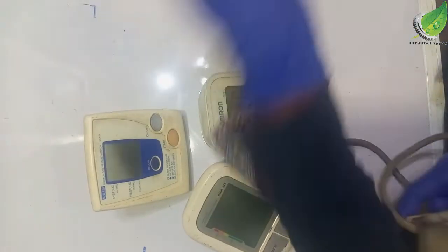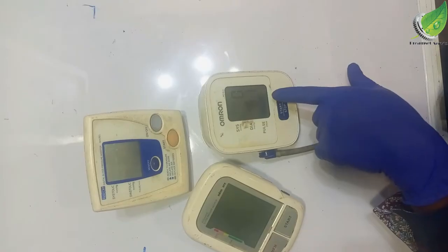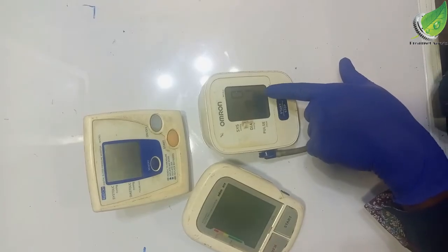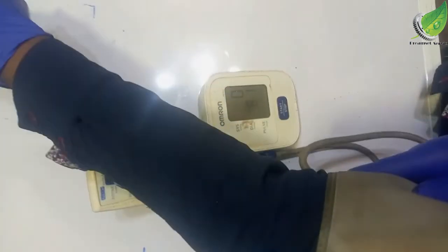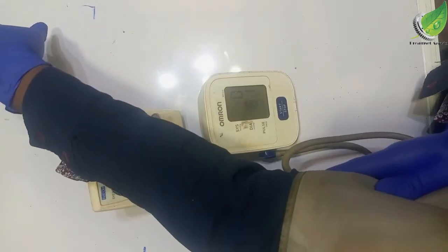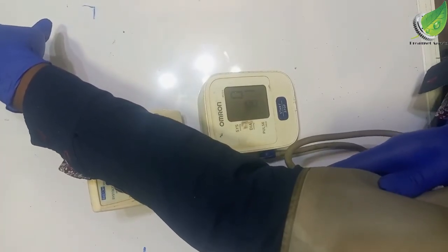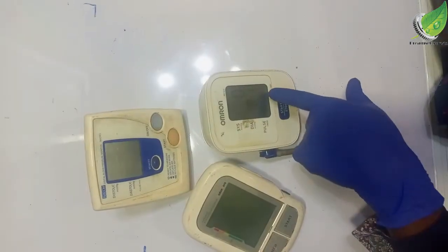Hello there. So you can see that we have error E1. One of the things that could cause this error E1 is if your cuff is loose. When it's loose, the pressure of the air coming into the cuff is not able to make a reading. So that is going to give you that error E1.